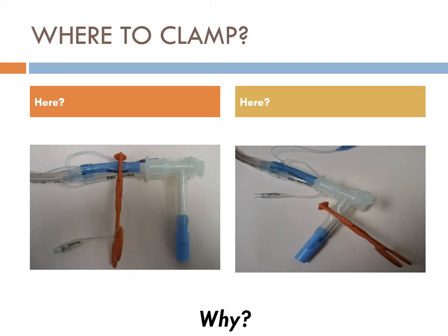So what could you do if you lost this piece? How could you ventilate through just the tracheal hole, but still ventilate both lungs? The clamp. Is that in the box up there? So one of the ways I can ventilate both lungs, if I lost the 2-to-1 piece, is to just clamp the bronchial like that, and now air won't come out of this tube because this tube is occluded from up here. I'll ventilate through this port because I only have this hooked up to my circuit.